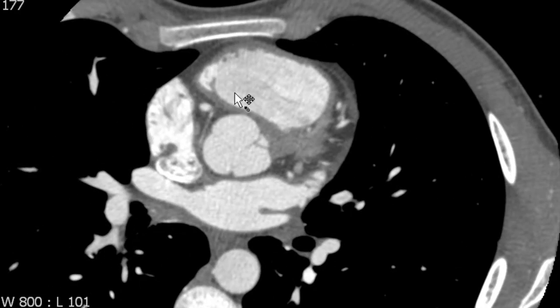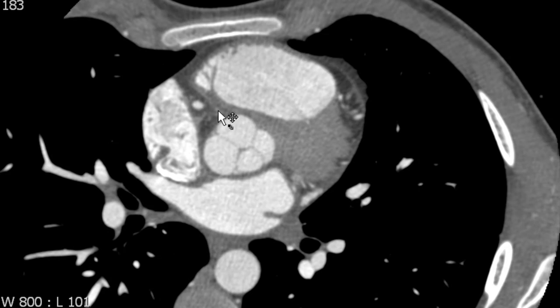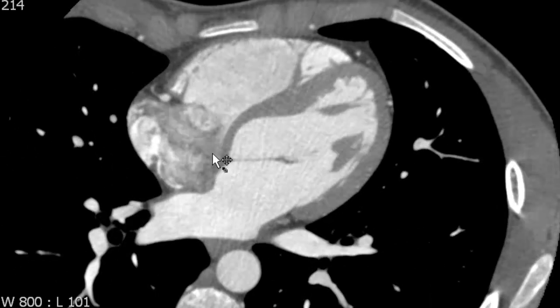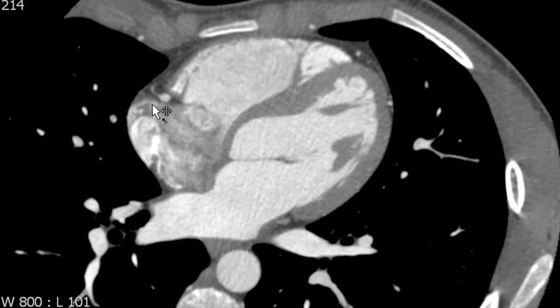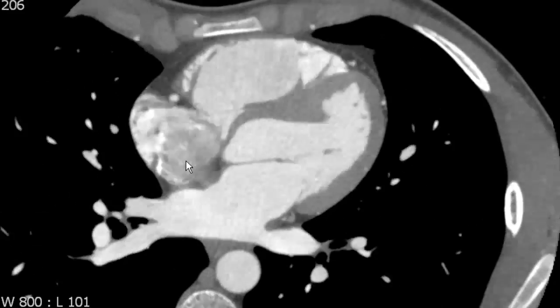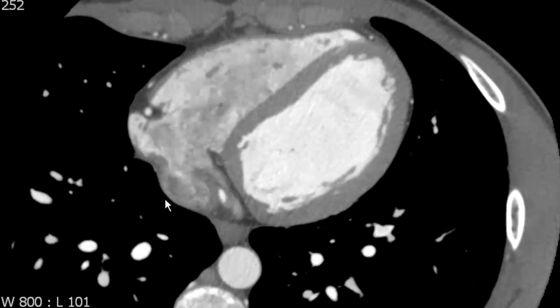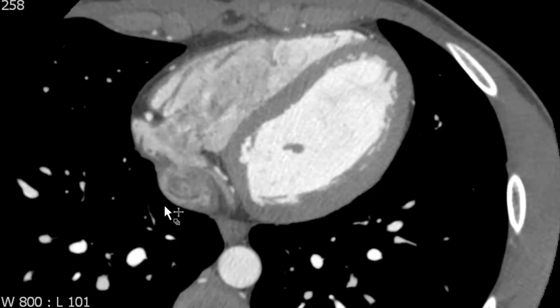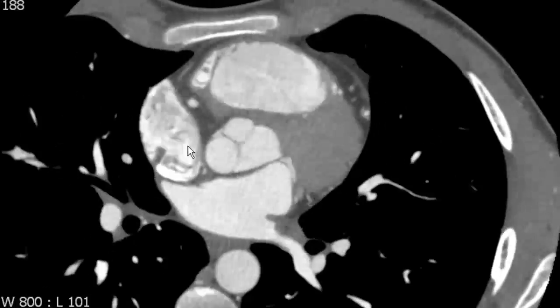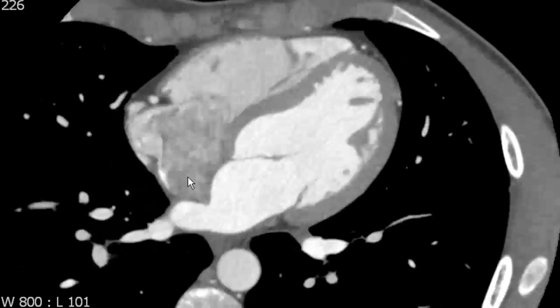Moving to the other side of the heart, we can see that there's a deeper sulcus that separates the right ventricle from the right atrium. So this is another AV sulcus or atrioventricular sulcus on the right margin of the heart. The right margin of the heart is also called the acute margin of the heart, and the vessel that lives in that sulcus is the right coronary artery.